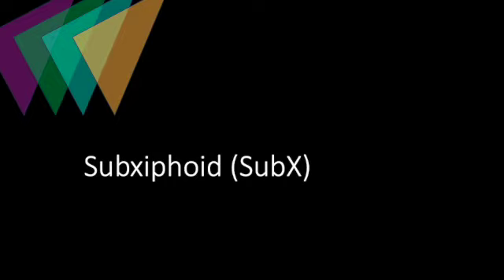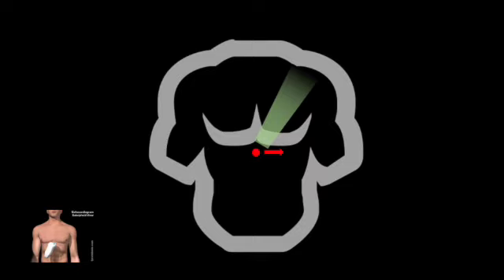Finally, our last standard view is the subxiphoid or the subcostal view. The subxiphoid view, as you might expect by its name, is obtained from below the xiphoid process and costal margin. With the probe indicator towards the patient's left side or towards the apex of their heart, the transducer often has to be pressed nearly flat against the patient's abdomen, as if you were trying to shine a flashlight up and under their rib cage to illuminate the heart. This view can be particularly uncomfortable for patients, so its utility is often limited to specific clinical scenarios.